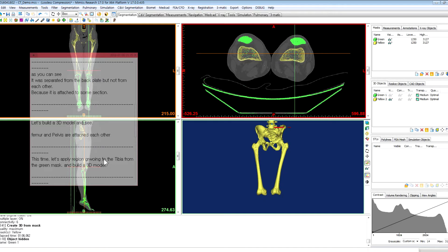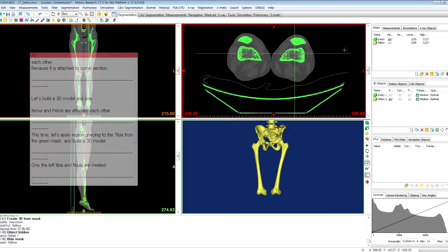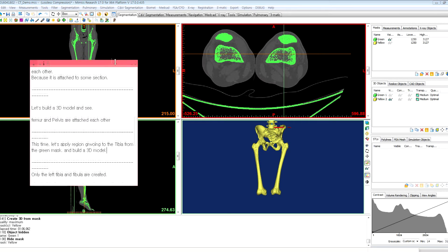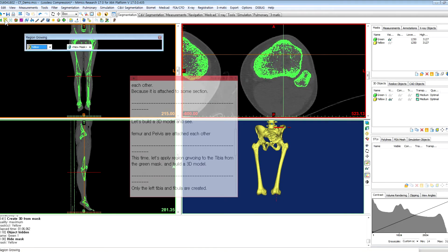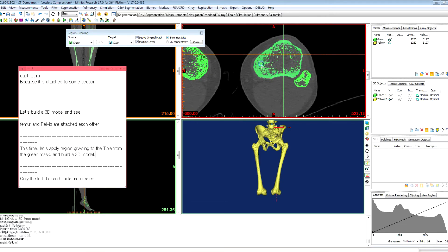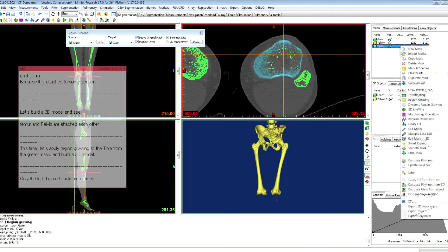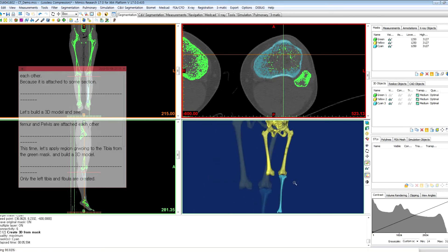This time, let's apply region growing to the tibia from the green mask and build a 3D model. I will hide the yellow mask, and we have to find a tibia section here and click region growing. Change the source to green, and check the new mask is different from yellow. Choose here — tibia. Calculate 3D and click calculate. As you can see, only the left tibia was created.